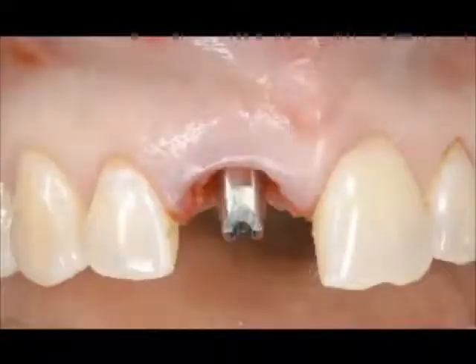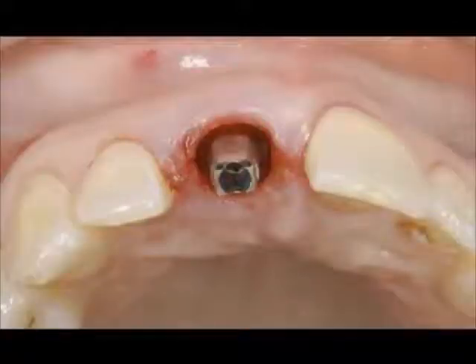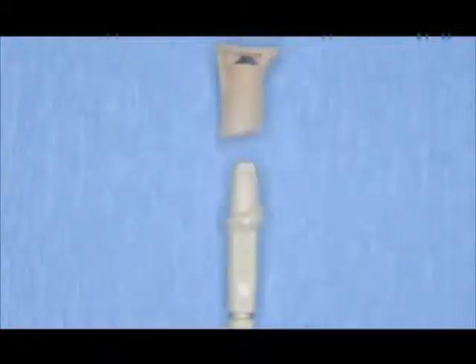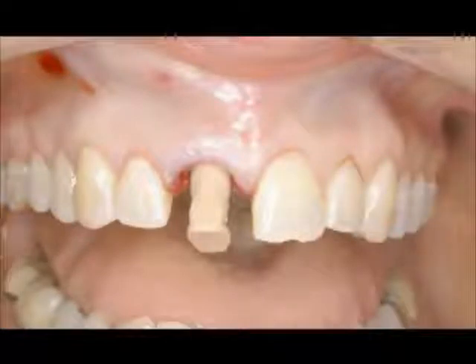We can temporize it at the time of surgery, and this is utilizing the new HLA contour abutments from Zimmer with snap cap componentry. This is the analog and the impression cap that goes with this system. And you can see it has a natural anatomic contour. And this is what the snap cap looks like.